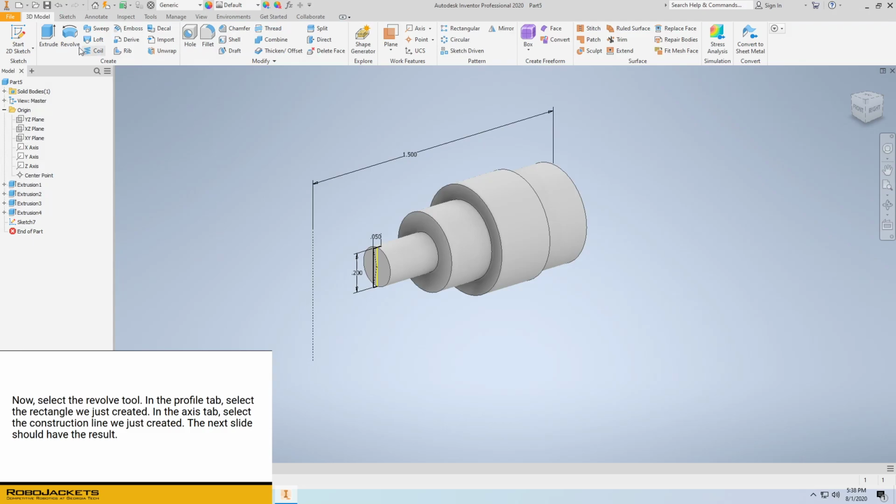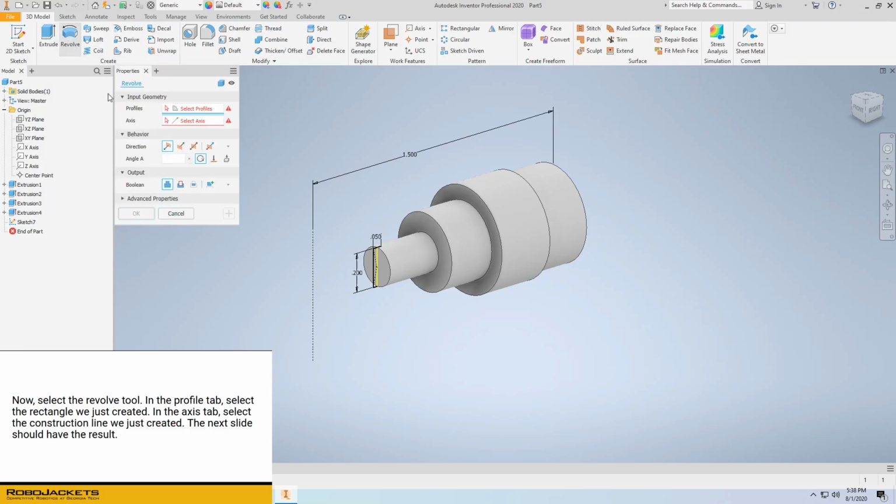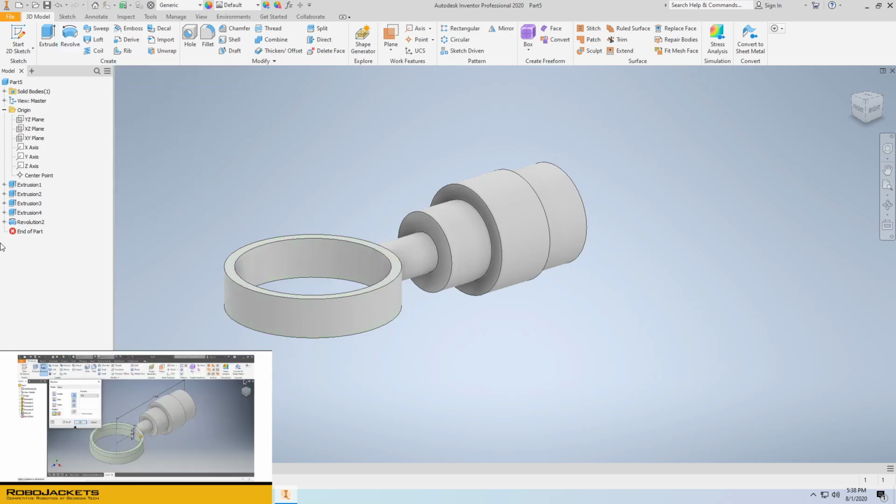Now we're going to select the Revolve tool with a profile of the rectangle and an axis of that construction line, creating this nifty design. As you see, the results should match, and this is the finger hold.